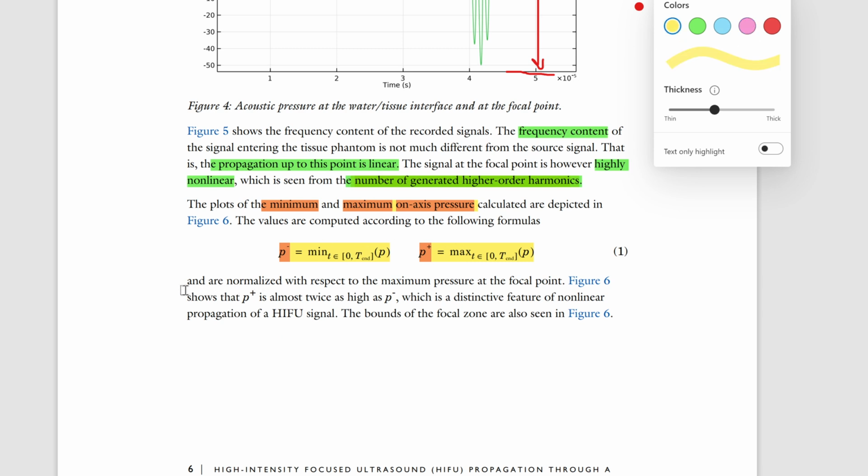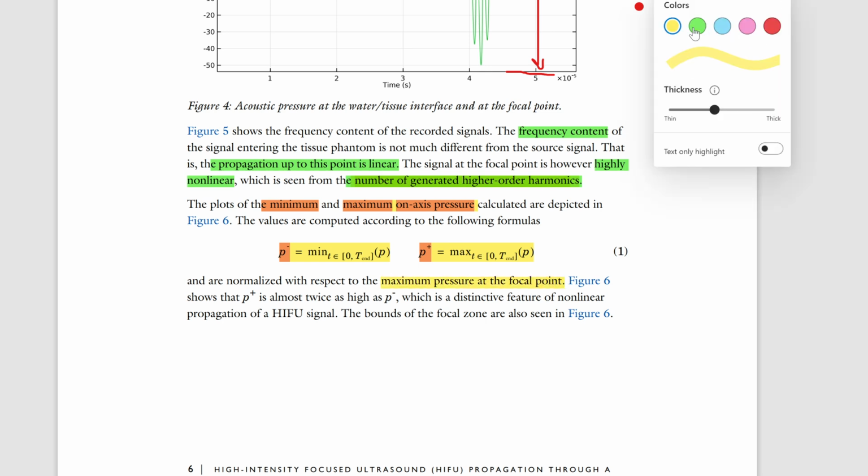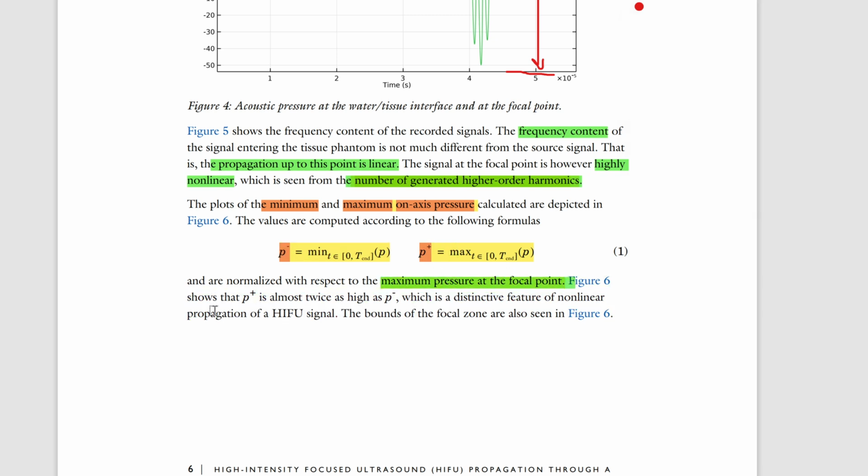And normalized with respect to the maximum pressure at the focal point. Okay, well now we know what that is. Now we know what Pmax was. So Figure 6 shows that, here we go, what we just saw. The maximum on-axis pressure is almost twice that of the minimum on-axis pressure, which is a distinctive feature of nonlinear propagation of a HIFU signal.